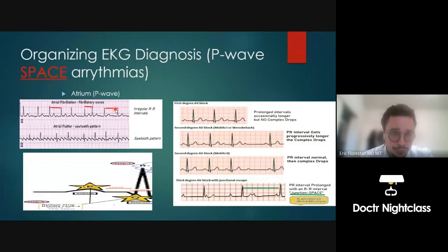All right, so these are the arrhythmias that are going to jump out at you. They have very, very specific characteristics. Sometimes there's a regular rate. We measure the rate from the RR interval. You see these red lines here? From this R complex to this R complex is a certain length, but then it's a different length here. So now we can say it's an irregular rhythm.